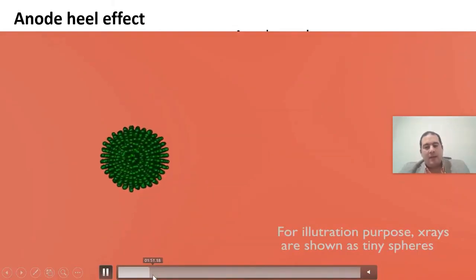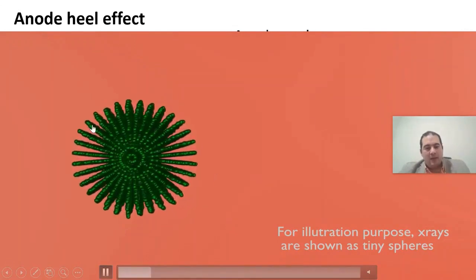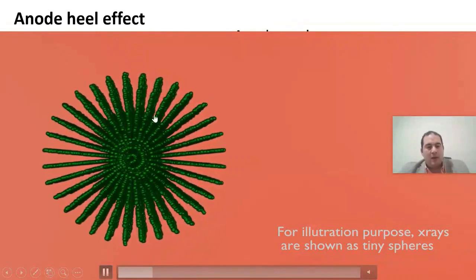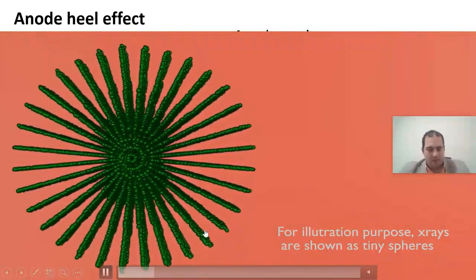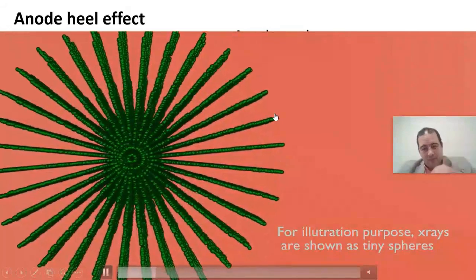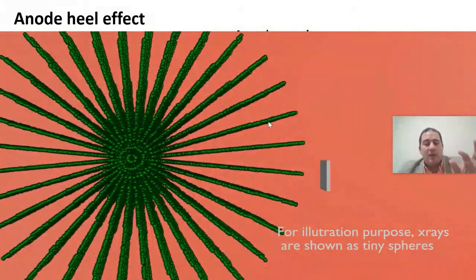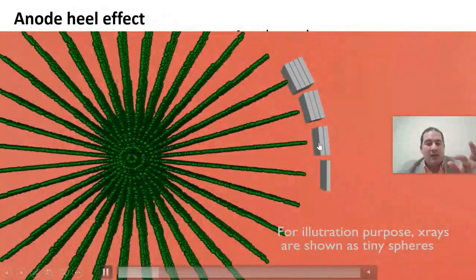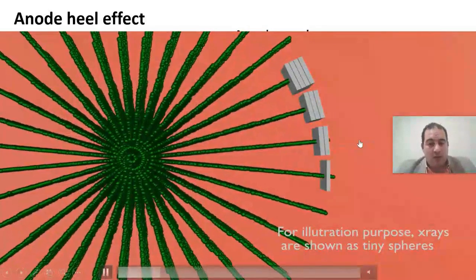Here it explains to you what happens. This is the X-ray beam that comes out as a result of what is inside the anode itself. And here are the X-ray photons coming out in all directions, very evenly. So, you will encounter the anode material according to its path. A small part inside the anode material will experience attenuation to a small extent, so the transmitted photons here will be large, while a larger part of the anode will experience transmission to a lesser degree, and so on.